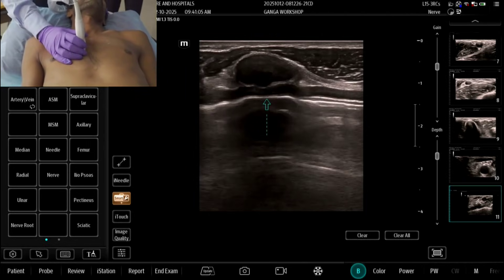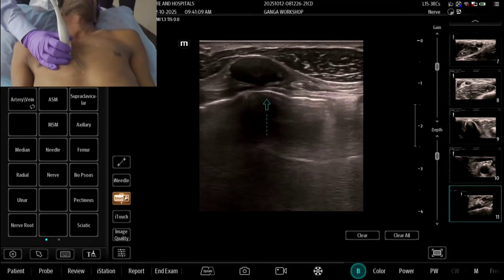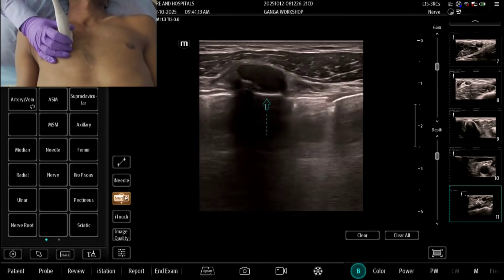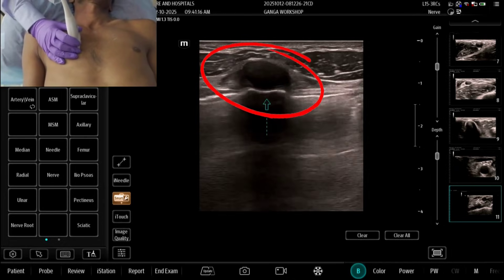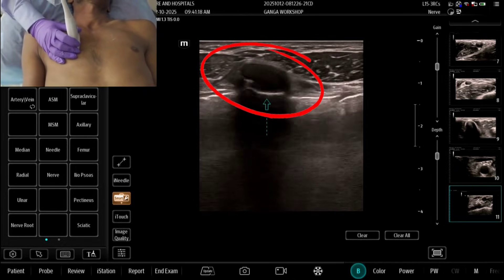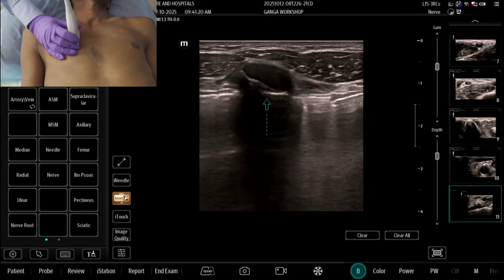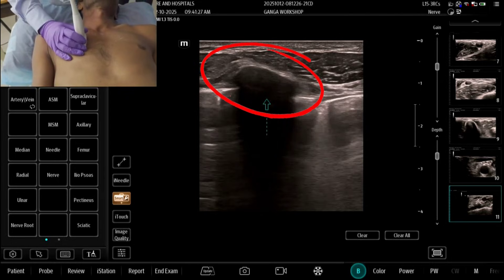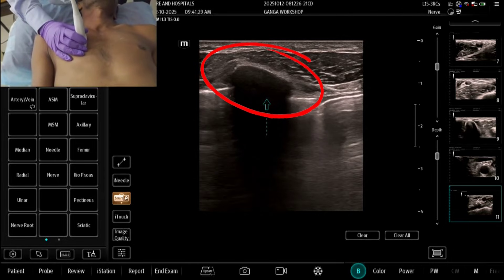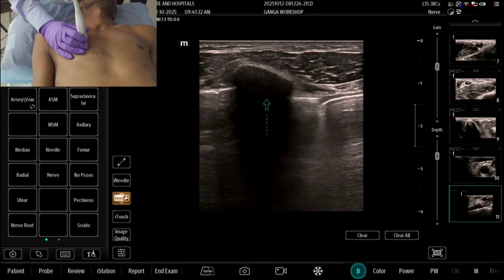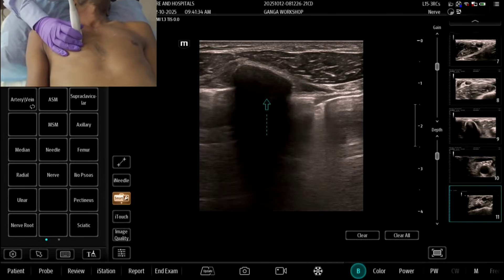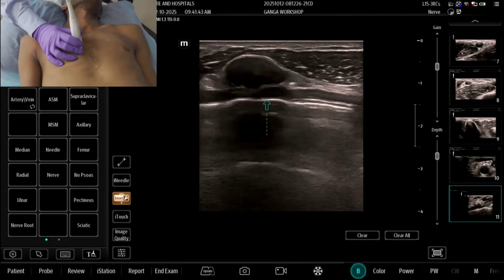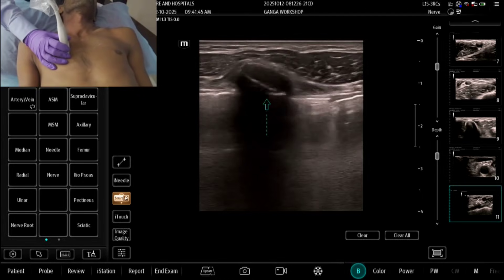Just follow with me as I move further laterally. Moving laterally, can you see a change in ecotexture? That is the costochondral junction. Now, further laterally, your elliptical structure has changed into a hyperechoic line casting an anechoic shadow — that is the rib. So this is the appearance of the costal cartilage and this is the appearance of the rib.